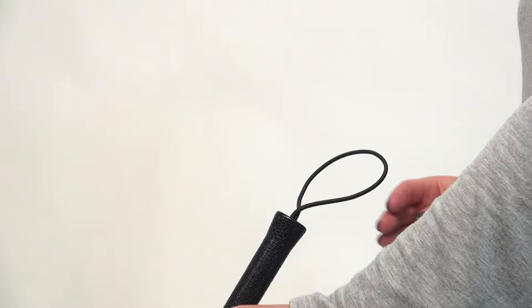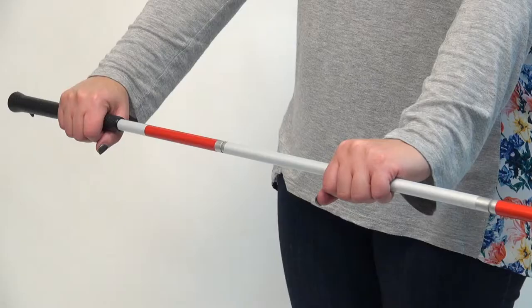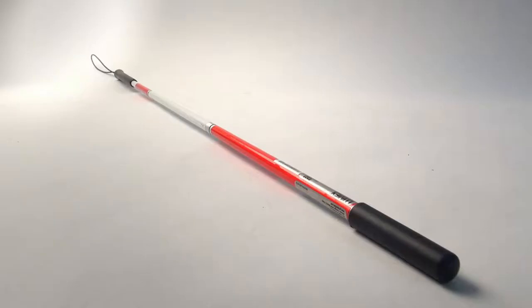The Lumex folding blind cane features a textured plastic handle for a better grip and comes with a convenient carrying strap. The cane folds compactly to 13 inches for easy transport and storage. The aluminum cane shaft is covered with red and white reflector tape for nighttime visibility. It is available in 41 and 46 inch lengths.